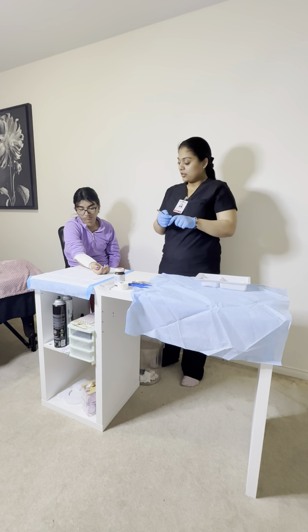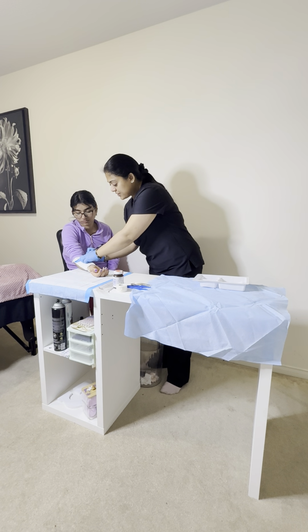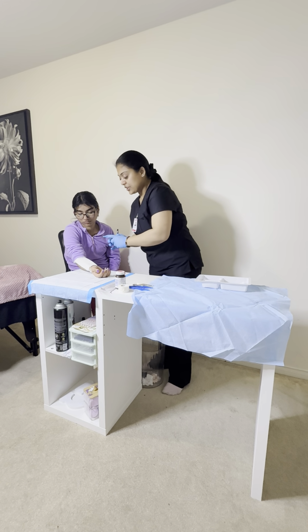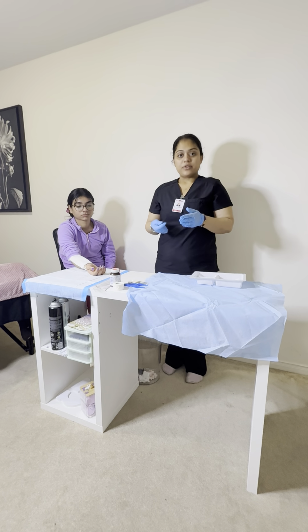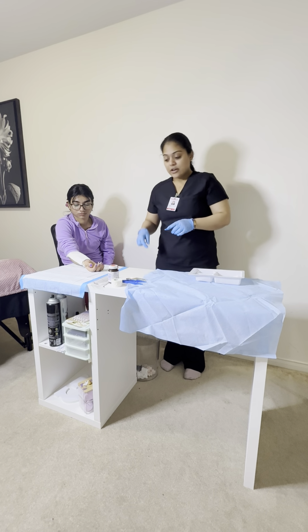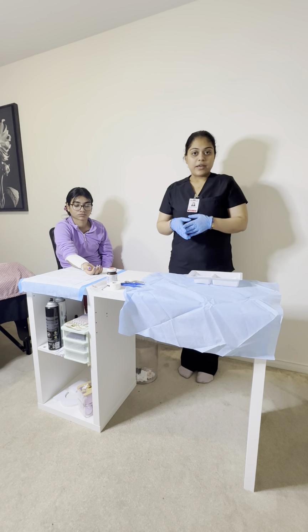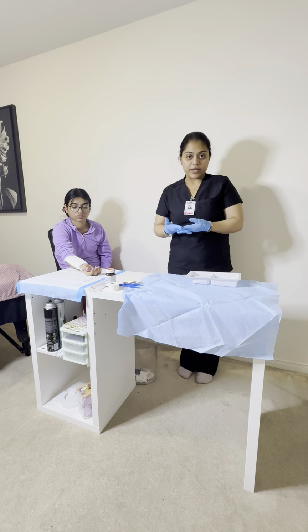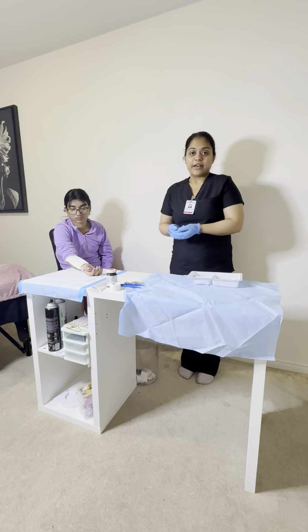And importantly, going to write the time and date of the dressing change, just to let other nurses know when the dressing was last changed. Now I'm going to clean all the area and put all the supplies in the BMW waste accordingly, and going to document the findings.